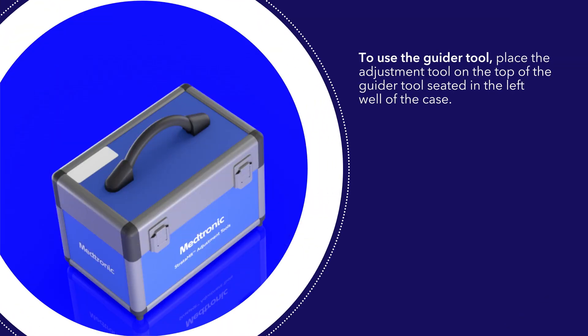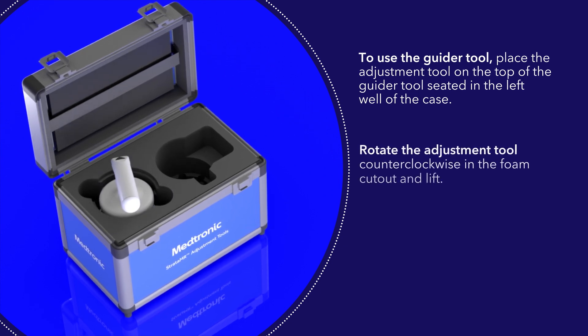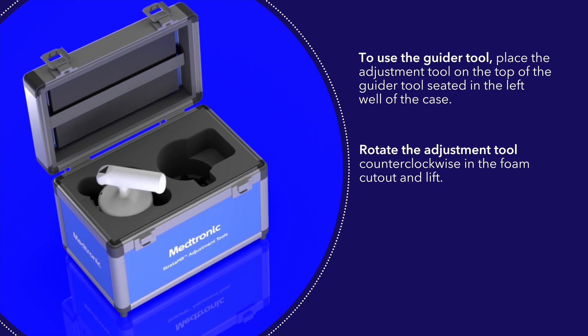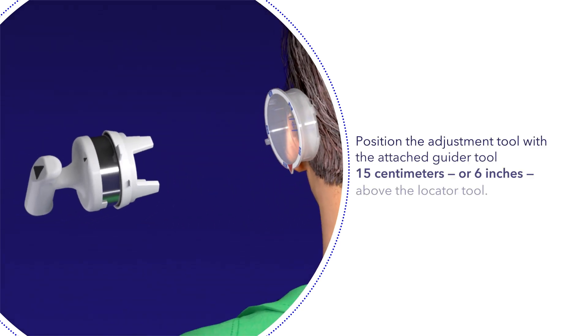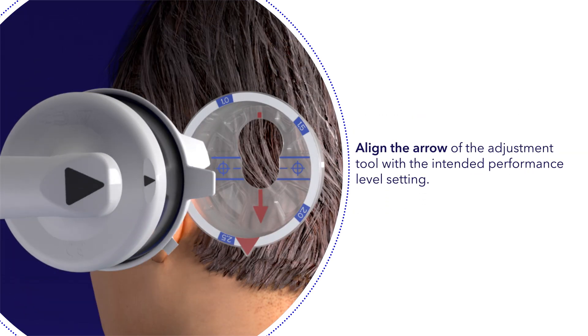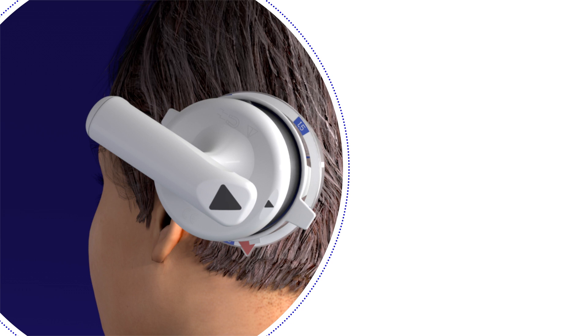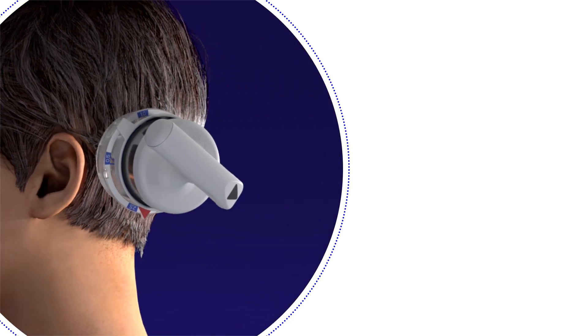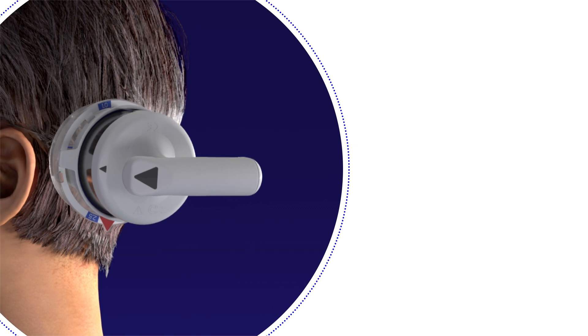To use the guider tool, place the adjustment tool on the top of the guider tool seated on the left well of the case. Rotate the adjustment tool counterclockwise in the foam cutout and lift. The guider tool will now be attached to the adjustment tool. Position the adjustment tool with the attached guider tool 15 centimeters or 6 inches above the locator tool. Align the arrow of the adjustment tool with the intended performance level setting. Insert the adjustment tool with the attached guider tool into the locator tool until fully seated. Turn the adjustment tool clockwise for two clicks, then return to its original position by turning counterclockwise for two clicks.